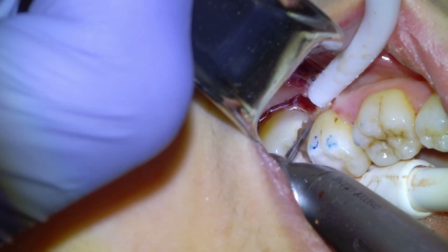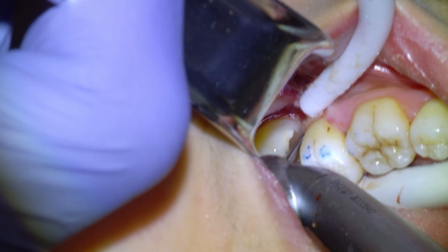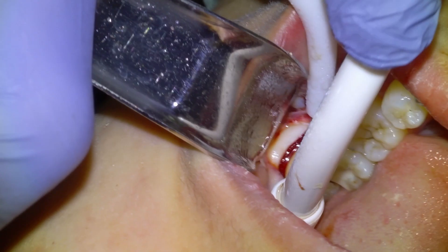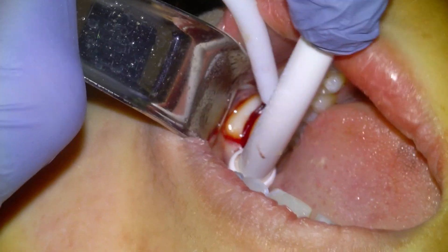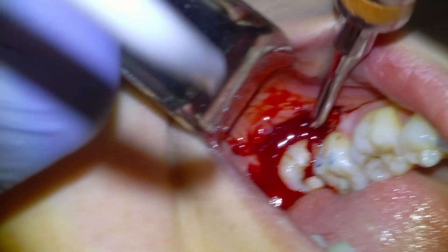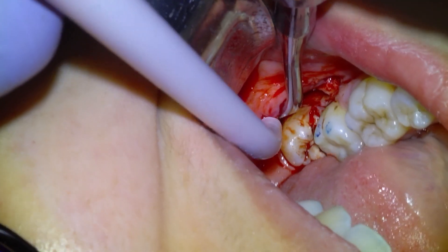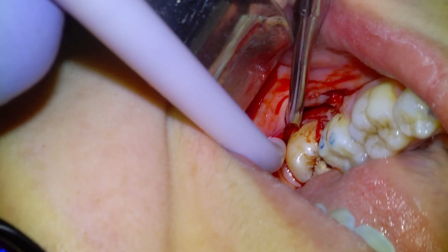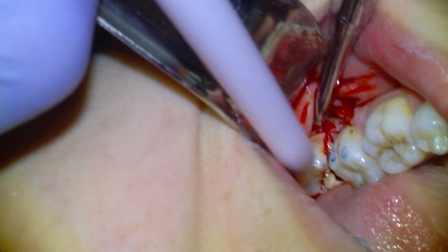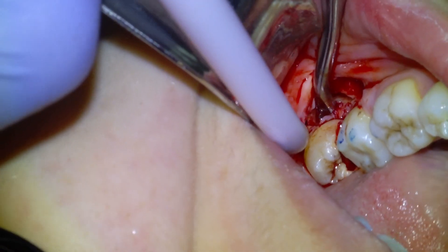Sometimes I'll also make a little cut on the mesial of the tooth just to ensure separation between the wisdom tooth and the second molar, to give it some space to be delivered. I'm going to go in with the elevator and begin luxating, getting the tip down as deep as we can. A little bit of enamel chips off there, but we'll continue elevating from the buccal and get good luxation right off the bat. We're actually nearly able to deliver the tooth with just the elevator from the buccal.